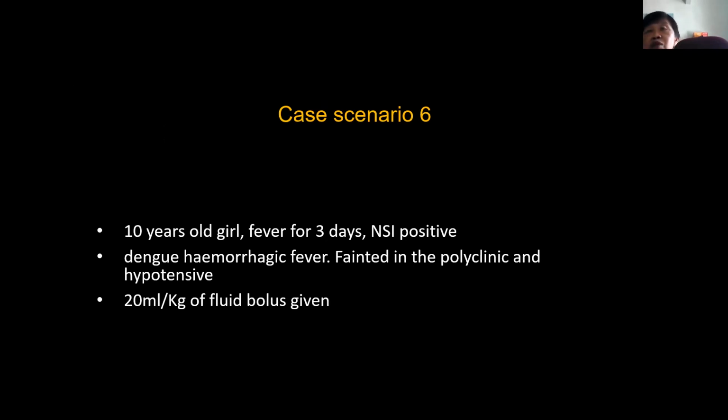So now we have case scenario 6, which is ultrasound, where I want to demonstrate the use of ultrasound of the abdomen. Ultrasound abdomen can be used to diagnose things like intussusception and appendicitis, but we will not go into it. We will just talk about this case, which we now see quite often, which is dengue fever. This patient is 10 years old, had fever for 3 days, and the NS1 was positive. So he has been diagnosed as having dengue fever.